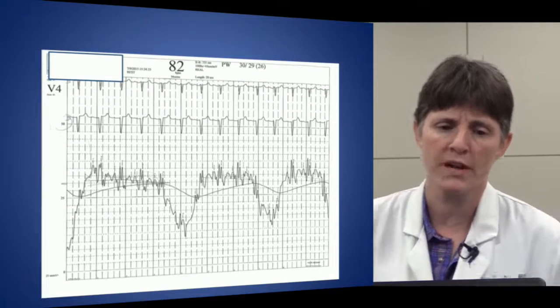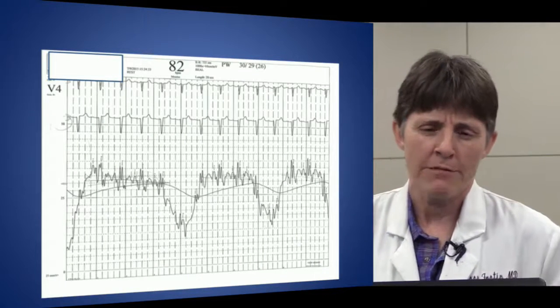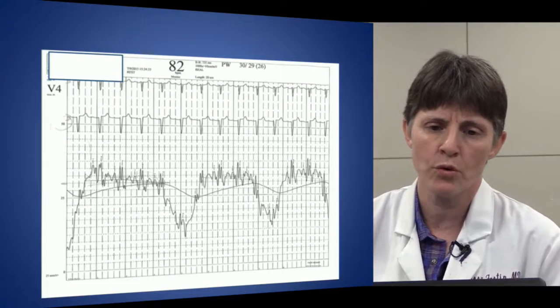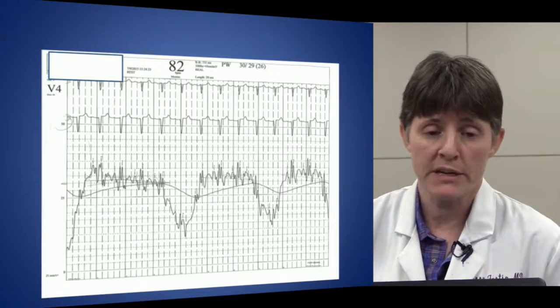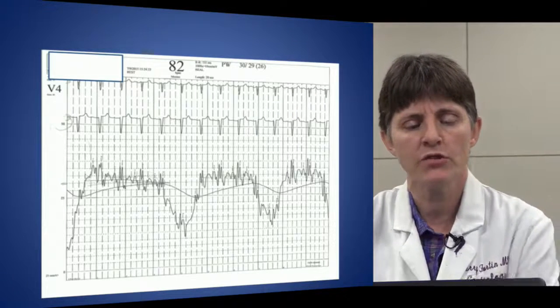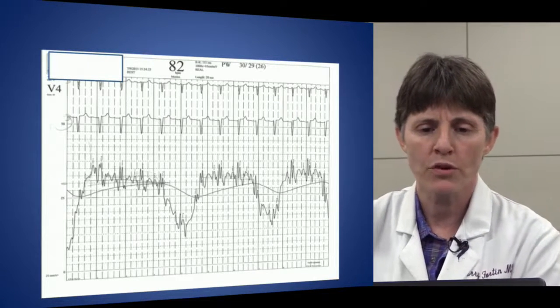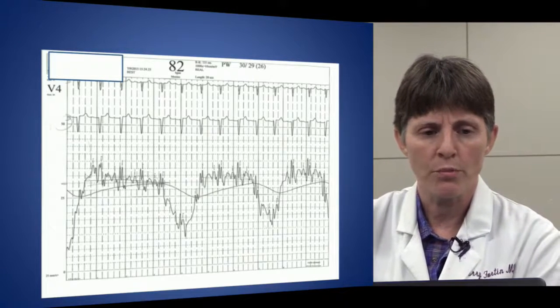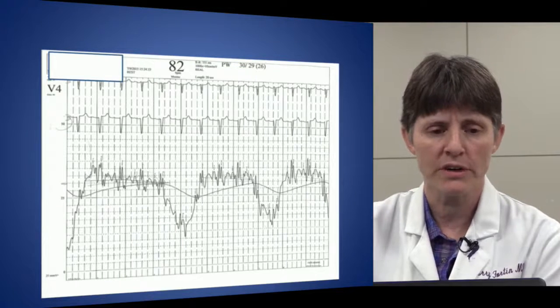And this is a wedge tracing. So again, very much less swing in our tracing. So the chamber that you're in is not really a chamber. You're now distally in the pulmonary artery and you're transducing pressure backwards. So there's much less sharp upstrokes. Again, the overall pressure is not normal, so this is 0 to 50 scale.